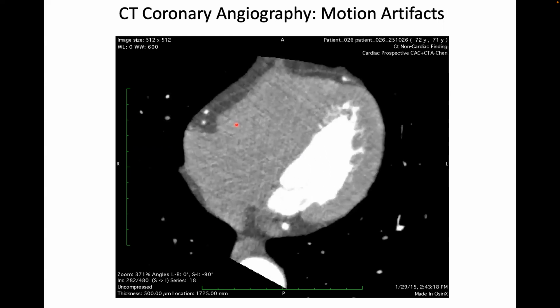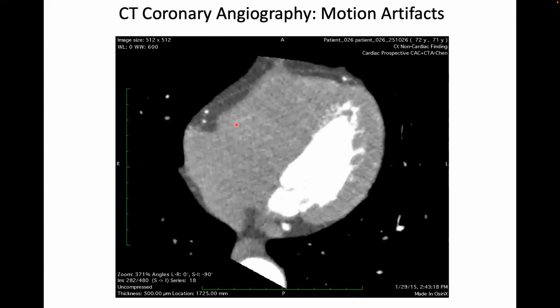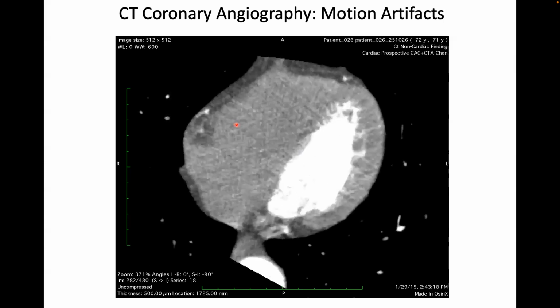You can make CTs of moving objects, and it's obvious you can, because in the frame of reference of a CT scanner, the patient is spinning at 4 hertz, right? So the patient is moving like crazy in a circle, but in a very prescribed way. So you just have to get the prescription right for the thing you're trying to reconstruct.